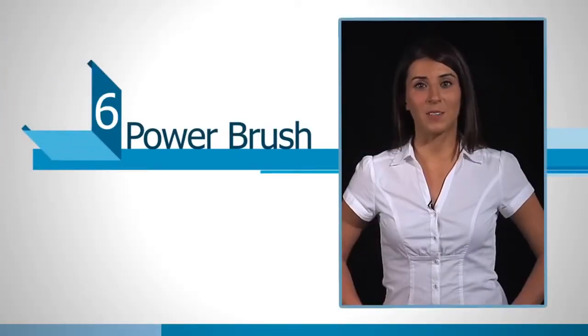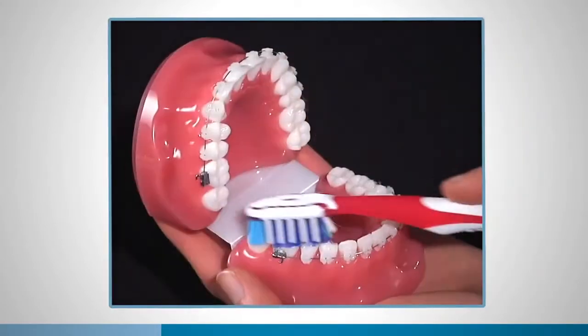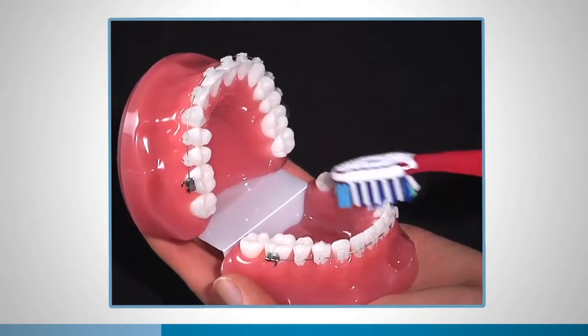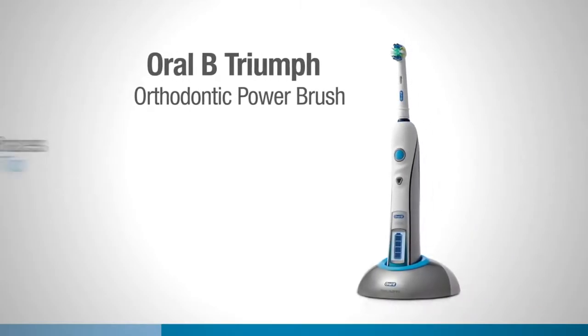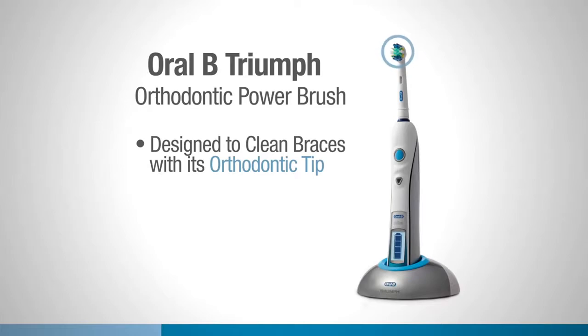Brushing your teeth with braces could possibly be the most important step in your oral healthcare routine. Most people are familiar with how to brush your teeth without braces, but when those braces are on, you want to make sure you're getting your teeth clean. This is an Oral-B Triumph Orthodontic Power Brush specifically designed to clean braces with its orthodontic tip.